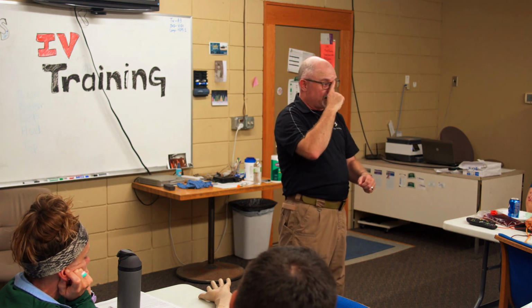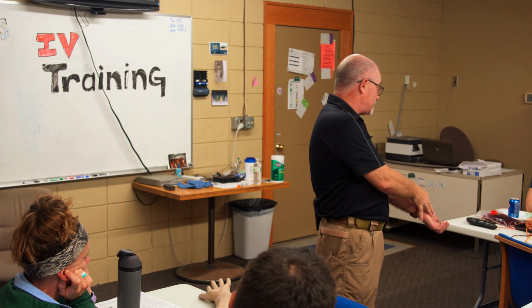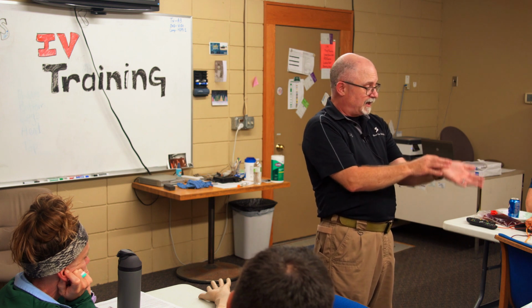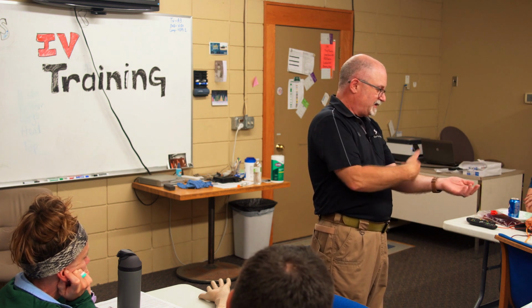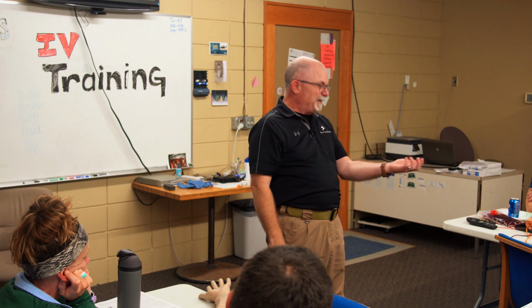One other complication or potential risk, which is a normal variant: you can miss the vein or go through the vein and actually get an artery sometimes too. It's very rare, but it does happen. I've seen it twice. My one partner was the ultimate perfectionist, and she did the IV, and we look back and bright red blood's working its way back up the tubing, and oh my God, I'm getting fire.